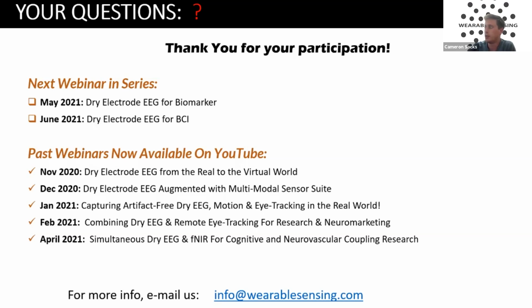What impedances do you get with your dry electrodes and what do you aim for? Great question. So we typically get somewhere between 500 kilo ohms to a mega ohm, and that's what we aim for. We're fine up to 2 mega ohms. We prefer not to go above that. When people usually are doing wet electrode, they're used to talking about 5 kilo ohms and 10 kilo ohms. And we're at a much higher range.